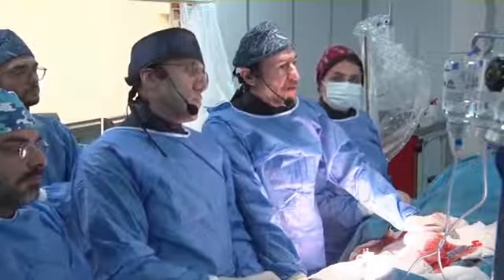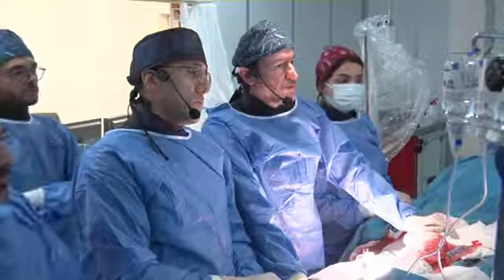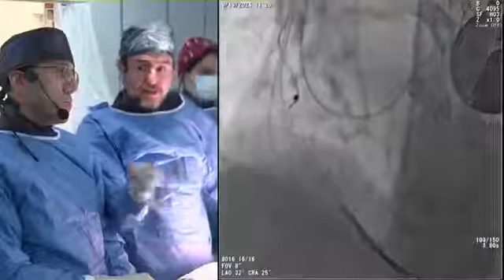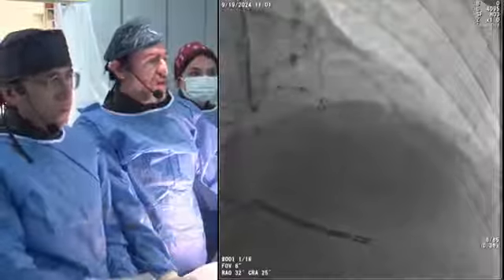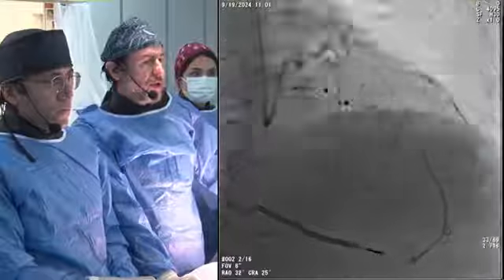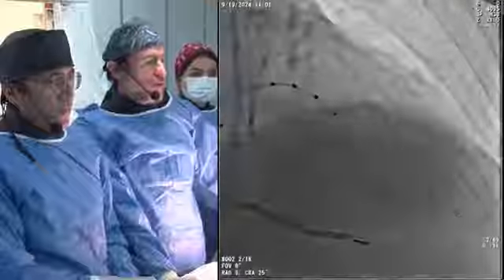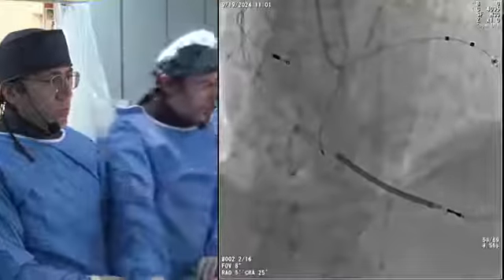Chef Cat, sorry for the interruption. Can you show your first angiogram, first view? Okay. Can you show the first angiogram, guys? So we have only taken this one here. The next one, please. This one here. Okay. So I will update you. We have a good channel there. The next one, please.